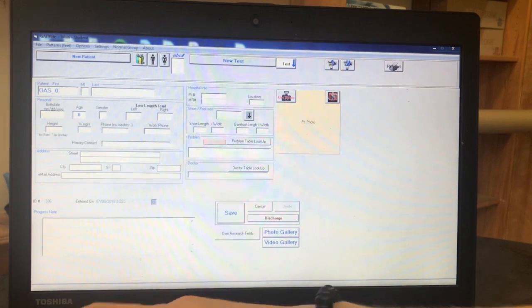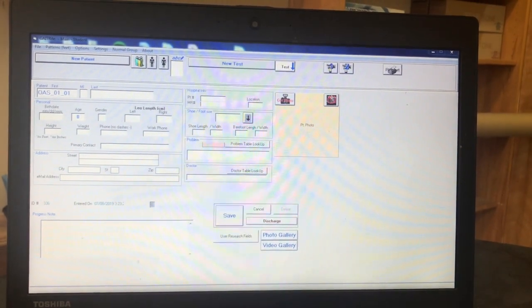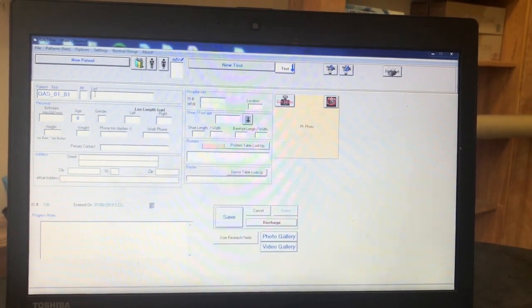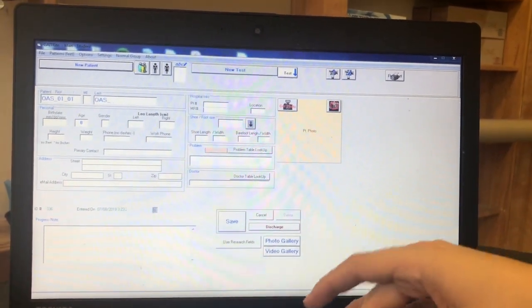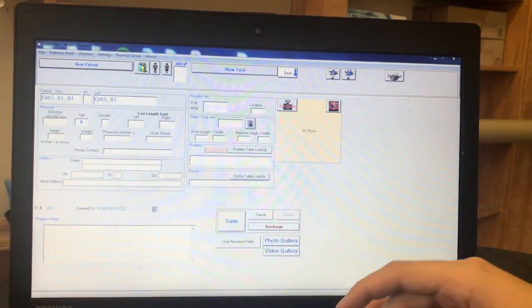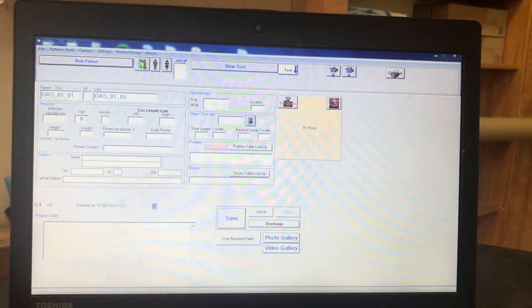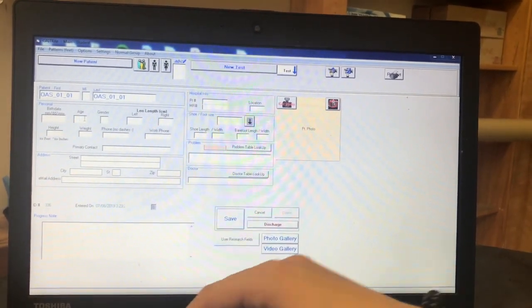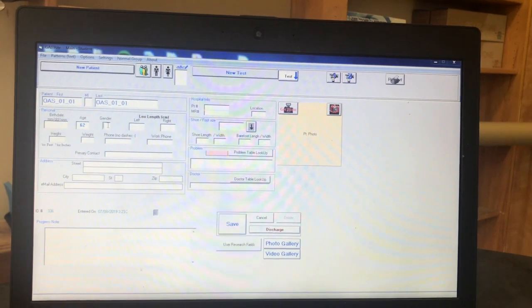For the patient's first and last name, repeat the OASIS code that the participant has been assigned. Next, fill out the participant's age and then gender with an M for male and an F for female. Click save.